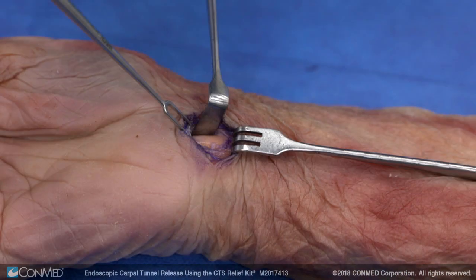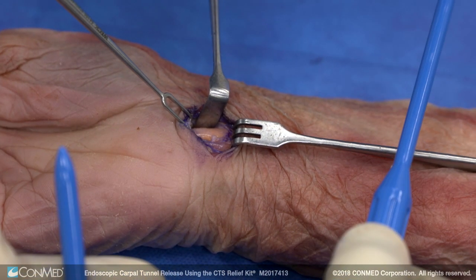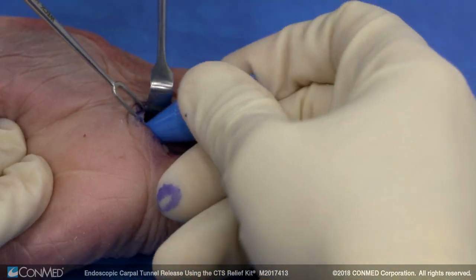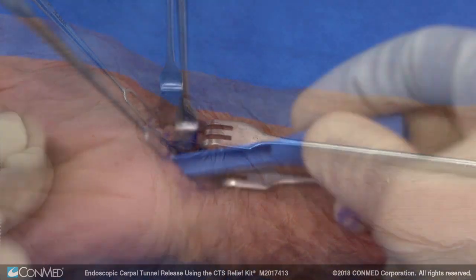We're going to use a skin hook to hold that up, and then we're going to use our dilators — we've got a smaller one and then a larger one to dilate for the carpal tunnel. So we're dilating first, second, and then we have our slotted guide.